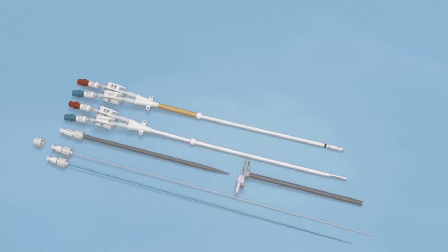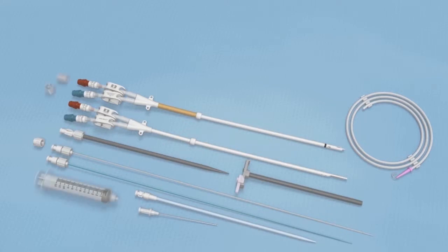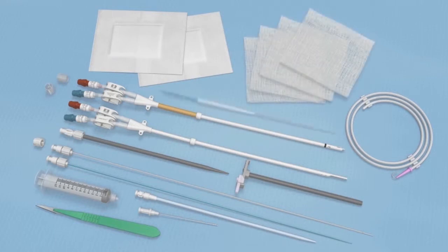Also included in the standard kit are one 18-gauge introducer needle, one 0.038-inch by 70 cm J straight guide wire, one 12 French tissue dilator, one 12 cc Luer lock syringe, two sealing caps, one number 11 blade scalpel, two Telfa island dressings, four cotton gauze sponges, and one bifurcated tunneler for the Palindrome Precision Chronic Catheter or a standard one-time tunneler for the MAHURKAR Chronic Carbothane Catheter.